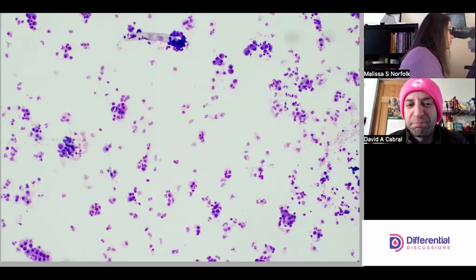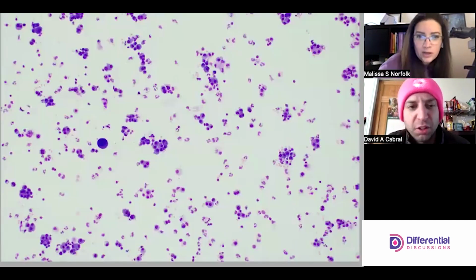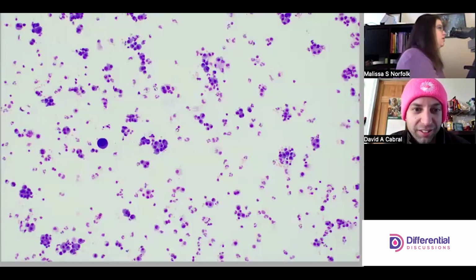So we'll take a look as we scroll on through. Ooh, that's a big sucker. Wow, that's huge and dark and ugly.